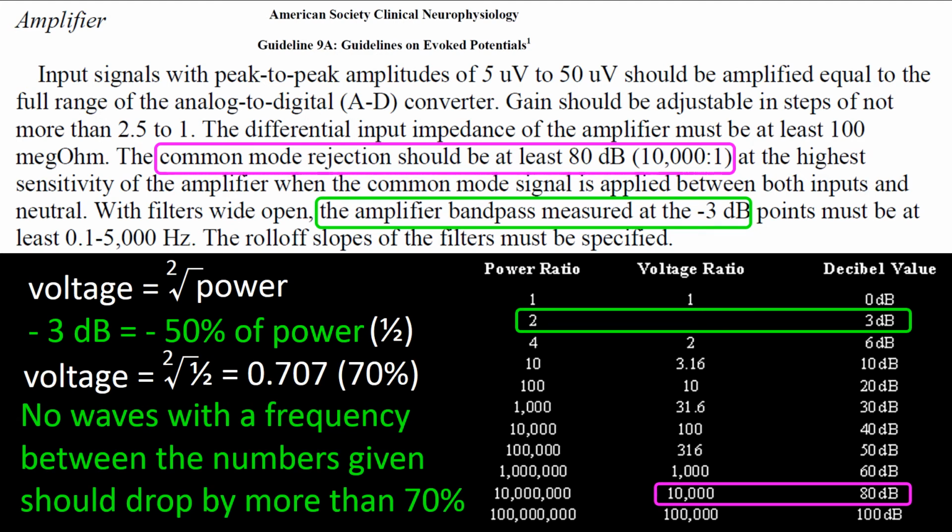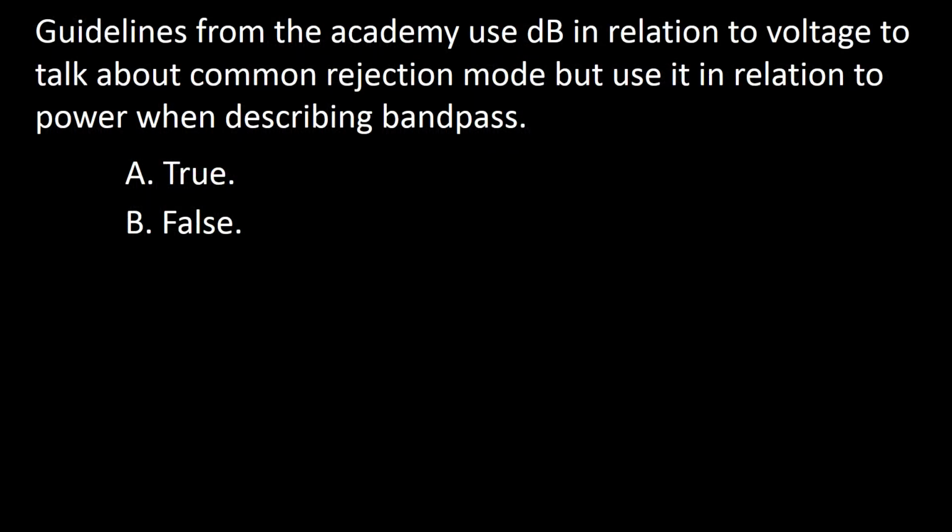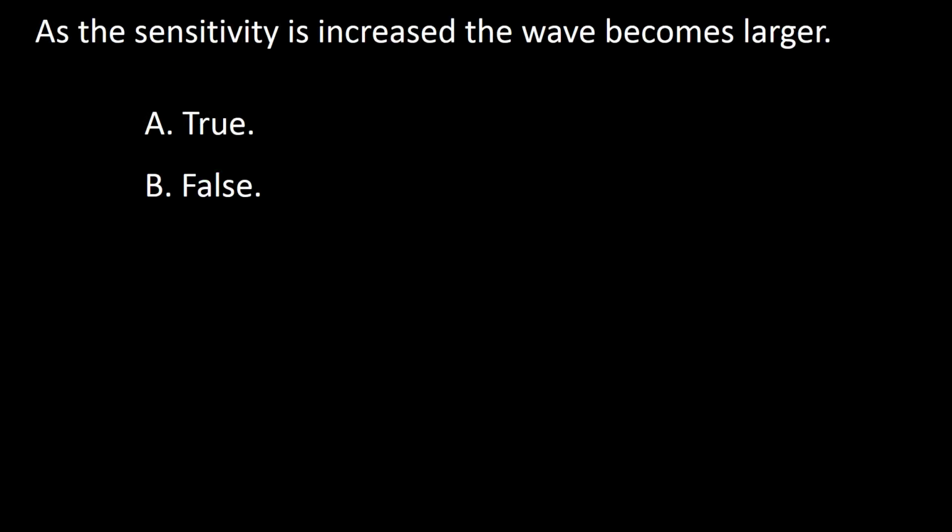So the bottom line is that no wave with a frequency between the numbers given should drop by more than 70%. So the answer to this question is true. Next question. As the sensitivity is increased, the wave becomes larger. True or false?